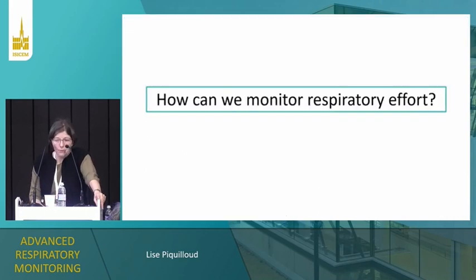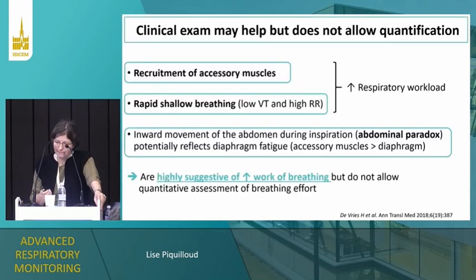Now, can we monitor respiratory effort at the bedside? Yes. First, and this is probably very important, clinical exam may help you. May help you detecting that inspiratory effort is probably high. But of course, you cannot quantify with clinical exam.